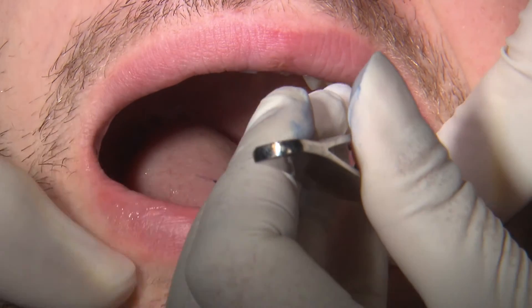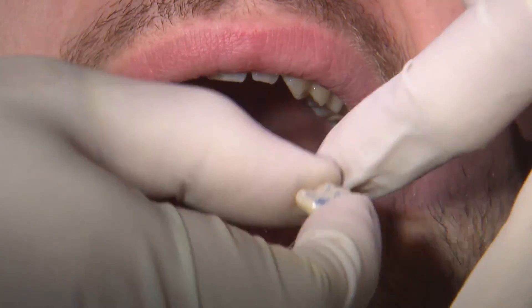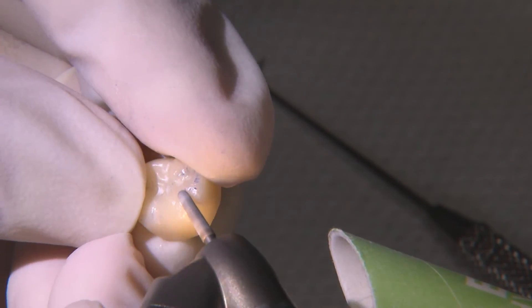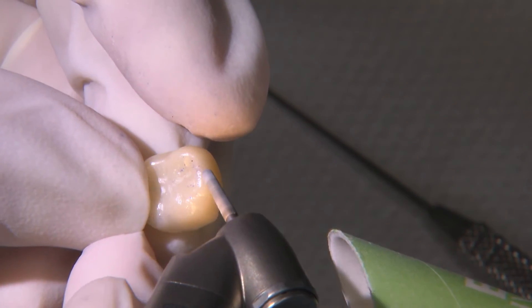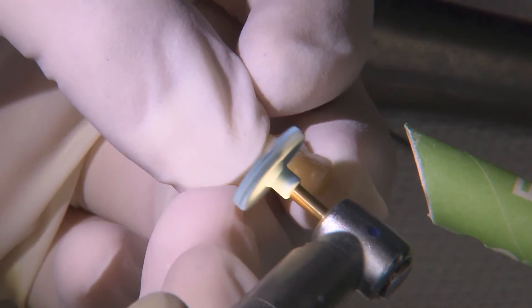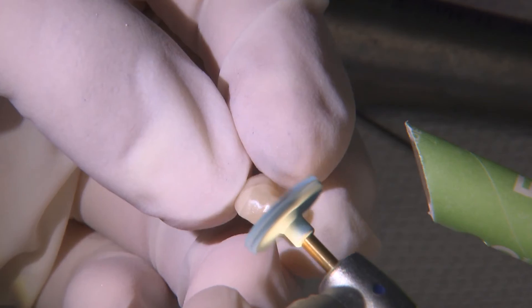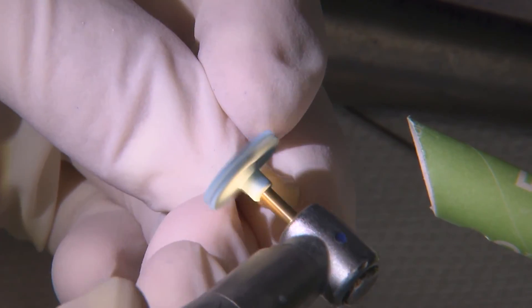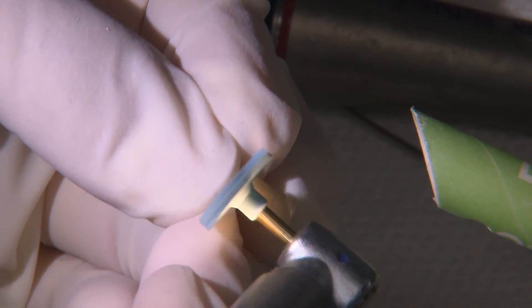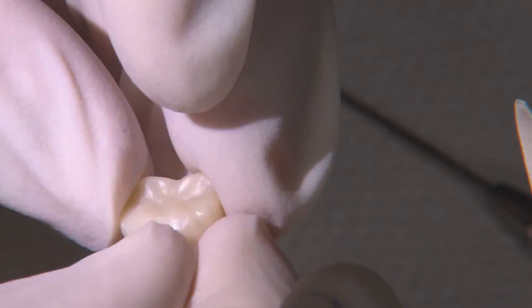Thank you, Megan. On this episode, I'll take you through the easy process of using the Glidewell.io CAD CAM system to fabricate a Bruxer crown chairside. We have a 28-year-old male whose chief complaint is pain and bleeding gums around the crown in his lower left quadrant. He presents with a full-coverage gold crown on his mandibular left first molar, tooth number 19, that has localized gingivitis characterized by swollen purple gums around the crown. The over-contoured crown with an extensive overhang is the primary cause. The plan is to replace the crown with a same-visit restorative approach utilizing the Glidewell.io chairside system.